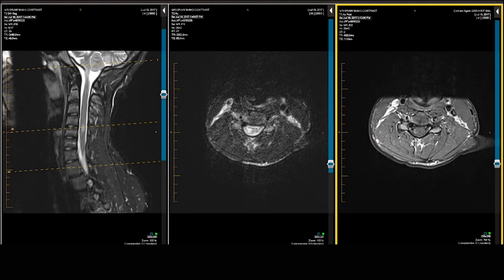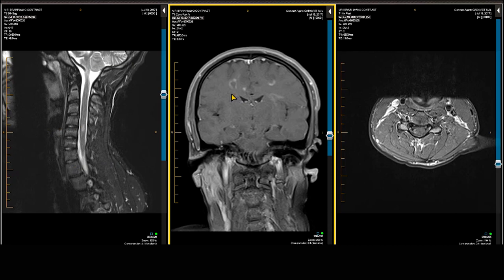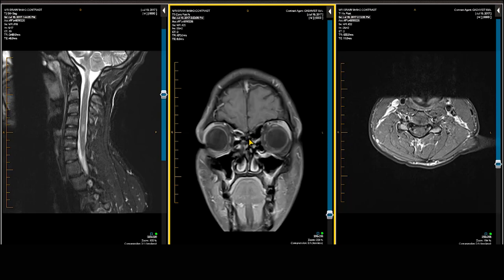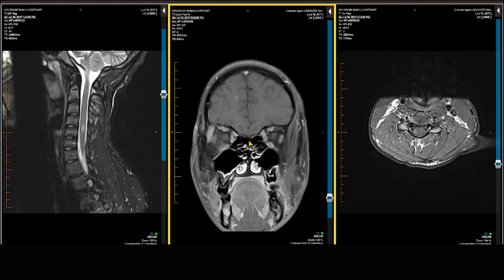To finish this illustrative case, usually the only sequence performed in the coronal plane is the post-gadolinium enhanced scan. You can reconstruct sagittal FLAIR scans into coronal planes, but the dedicated coronal acquisition is the post-gadolinium enhanced coronal image. This is the sequence used to look for demyelination or enhancement in the optic nerves, since optic neuritis is one of the manifestations of multiple sclerosis. The axial sections are usually too thick to see the optic nerves well in the standard MS protocol.